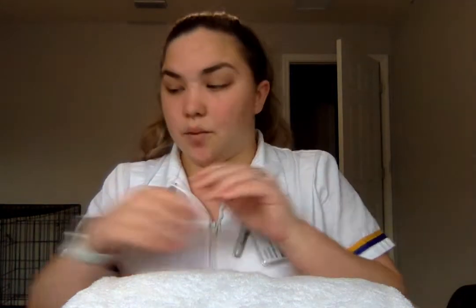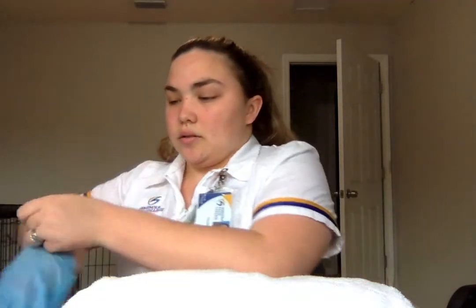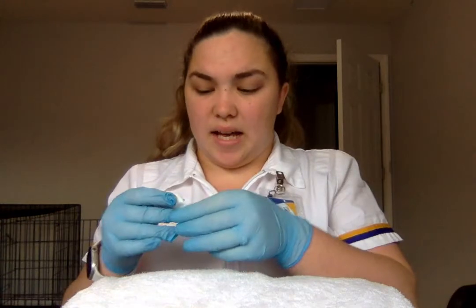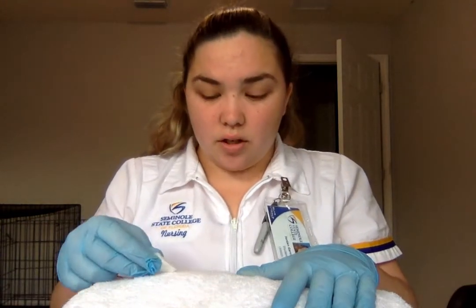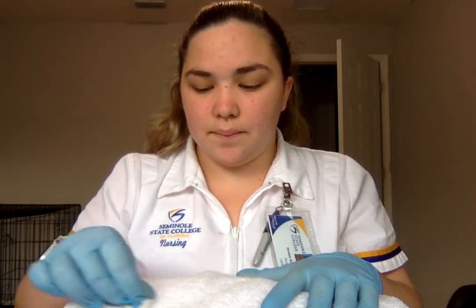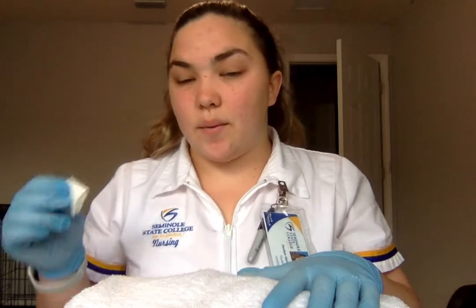So I'm going to go ahead and wash my hands. I'm going to apply my gloves. I'm going to cleanse the site with an alcohol pad. I'm going to go in a circular motion, starting inwards and moving outwards, in concentric circles. Okay, and then once I've cleaned the area, I'm going to allow it to dry. I'm not going to fan it dry. I'm not going to wipe it dry. I'm going to just allow it to air dry.